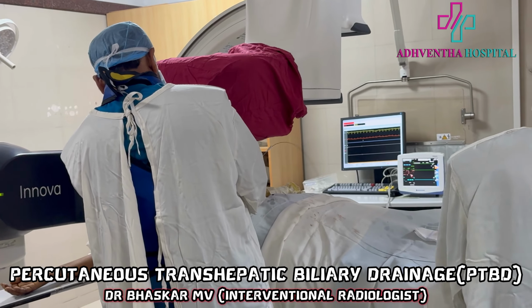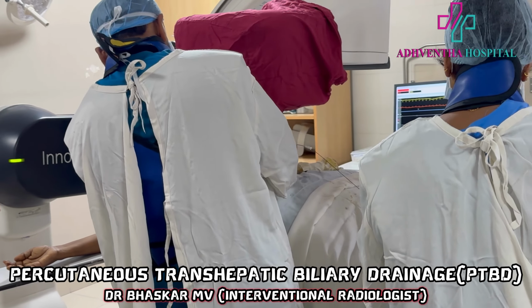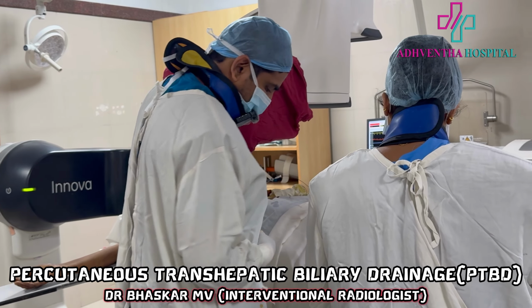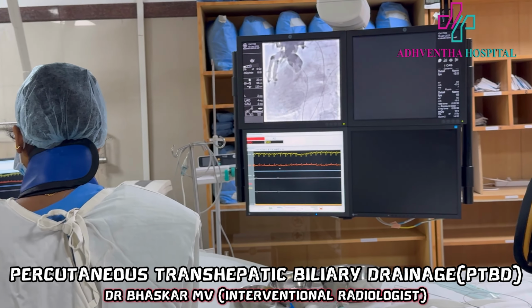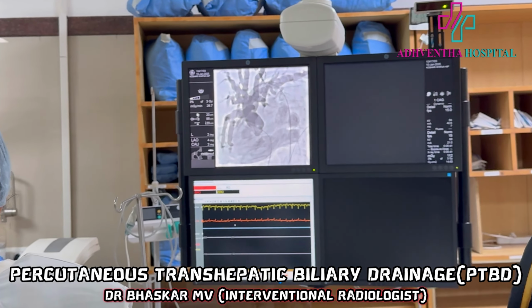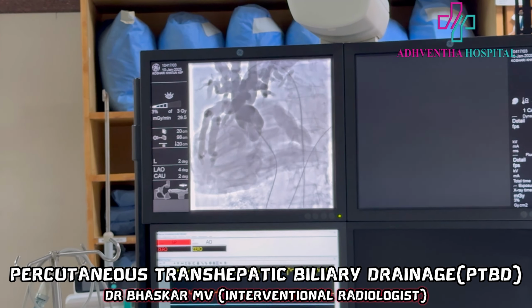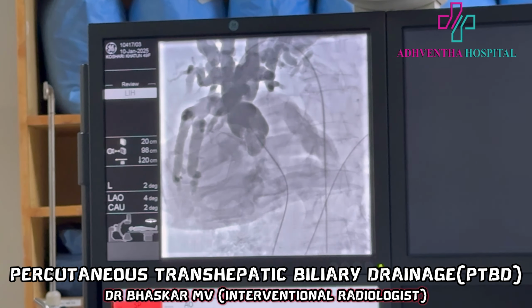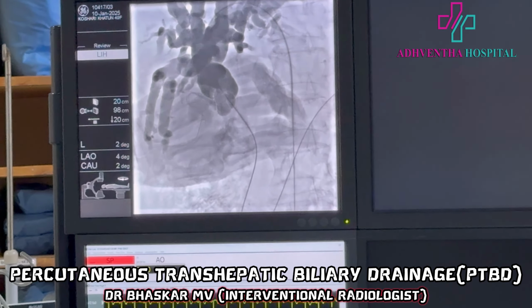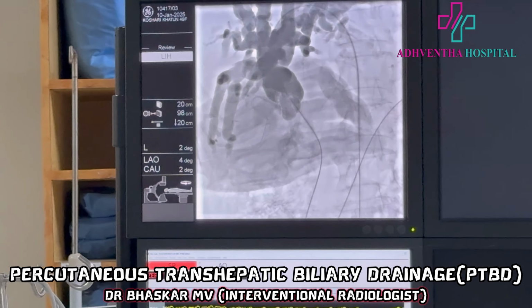Subcutaneous tissue also you have to dilate, and also the liver capsule. See the direction. So if you dilate the entire tract, it is easy to pass the multi-hole catheter.